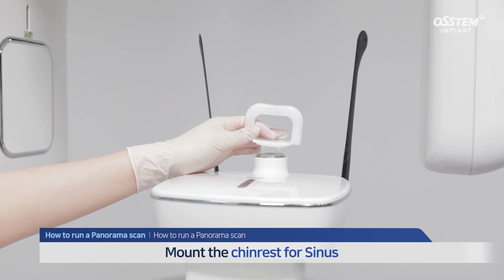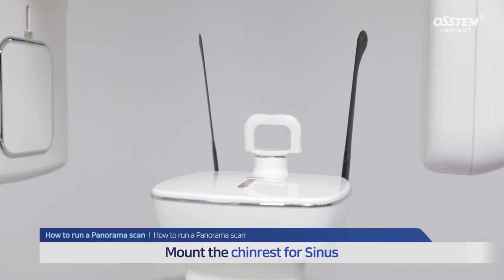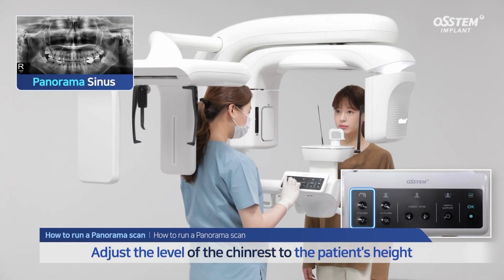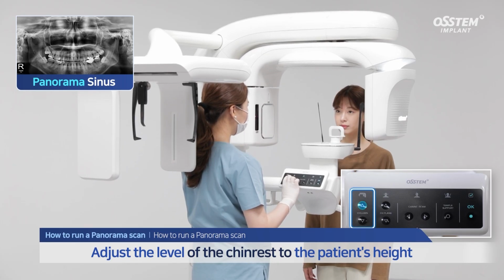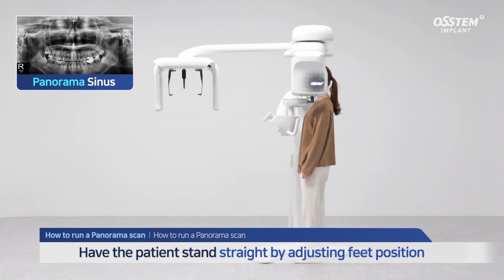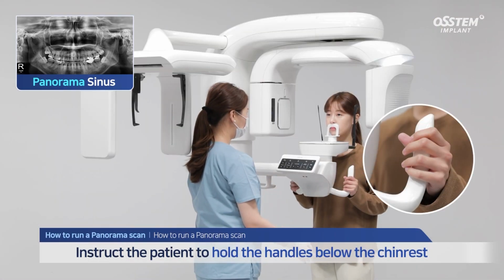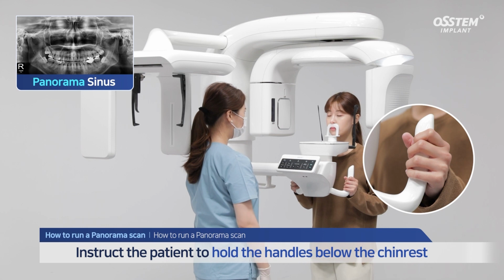Replace the chin rest with the one used only for sinus scans. Now, let's talk about the sinus scanning position. Adjust the level of the chin rest to the patient's height. Have the patient stand straight with their feet in a comfortable position. Instruct the patient to hold the handles under the chin rest.